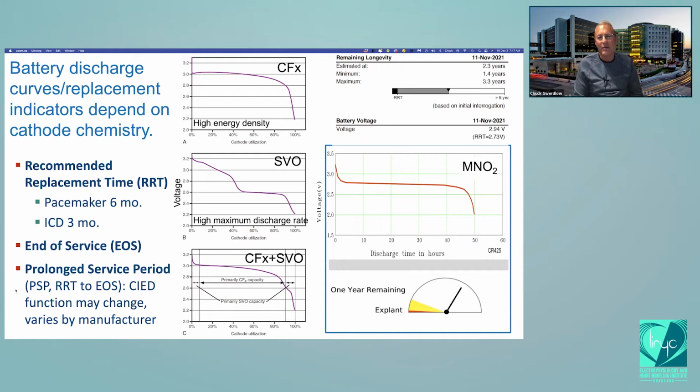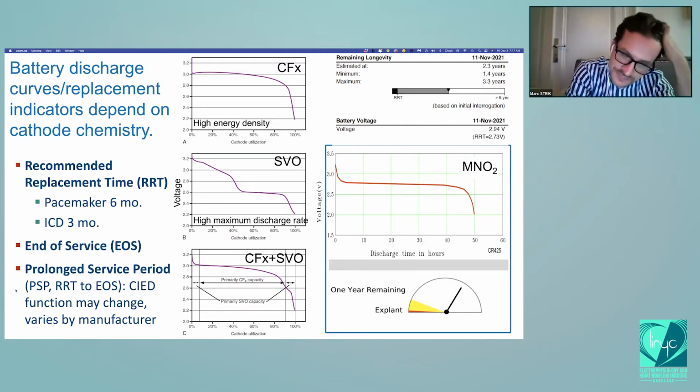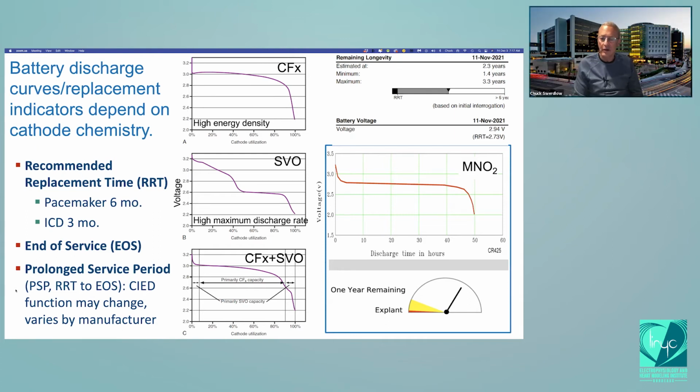They use, I forget what they use, and they have a different problem in measuring battery estimates. Typically they'll come up with an estimate that says 8 months. They'll give you the things that make me crazy. They'll say estimated time to replacement, 6 months, but range is 1 to 14 months, something like that. Exactly, that's the reason for the challenge. They use a different end of service indicator.